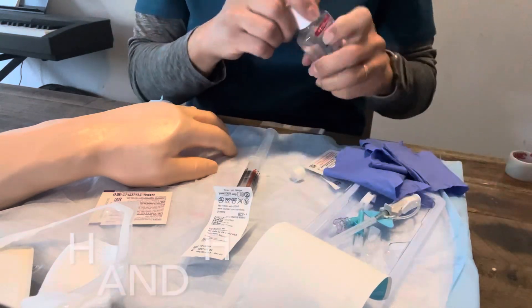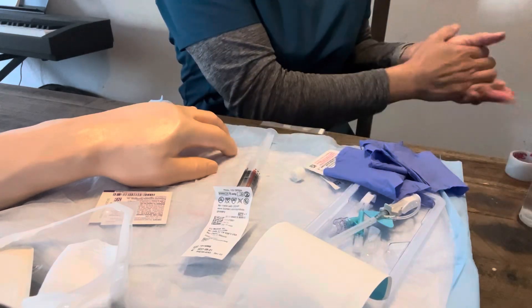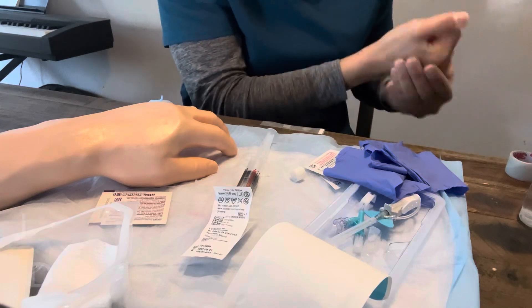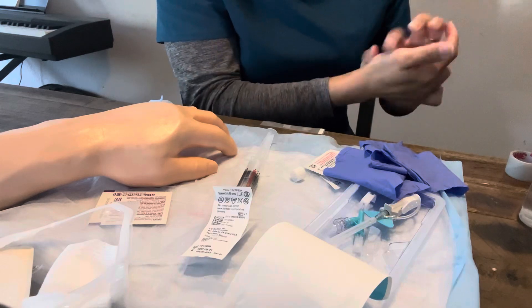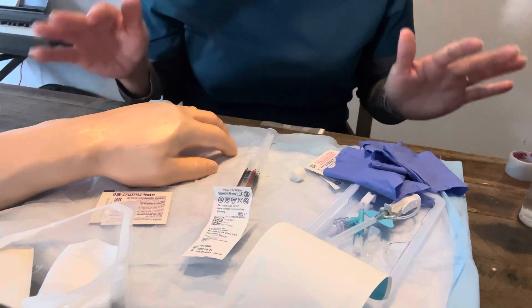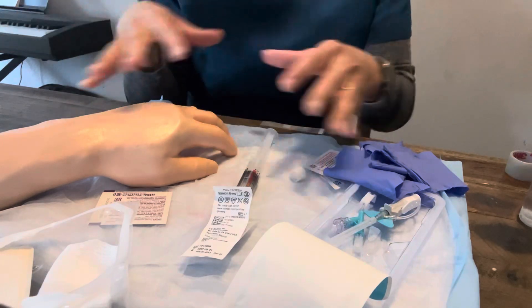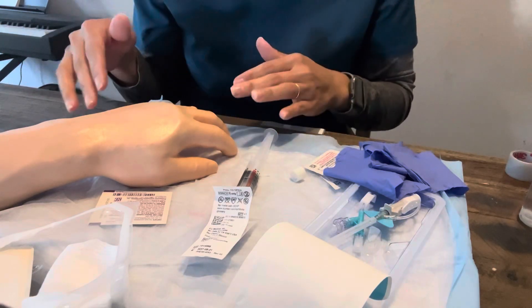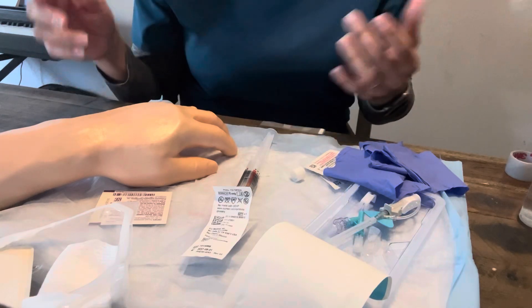Let's do hand hygiene one more time just to be safe. I've already introduced myself to the patient and asked orientation questions — that's a big thing I tell my students to do prior to inserting anything. We want to make sure the patient is alert and oriented, will follow commands, and won't be moving their arm when I'm trying to start an IV with a needle. Are they in any pain? Because prior to doing something potentially painful, I want to make sure I address their pain.